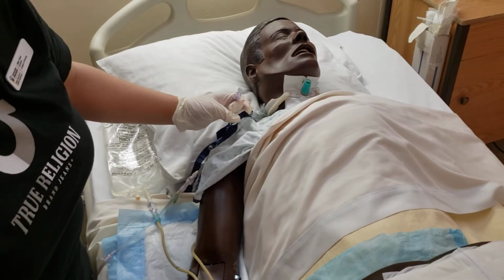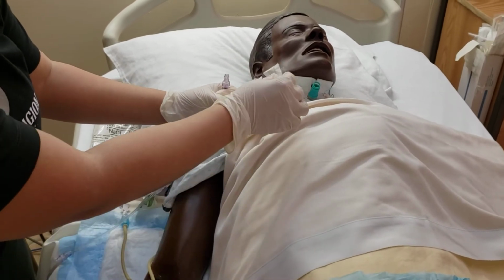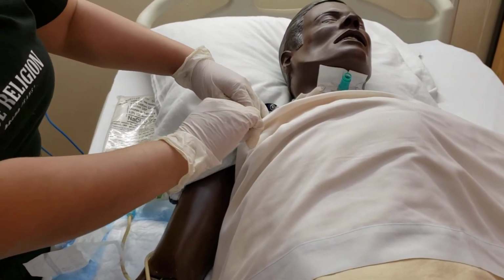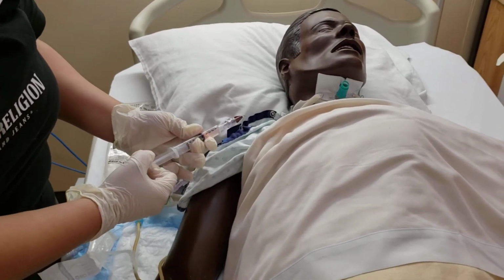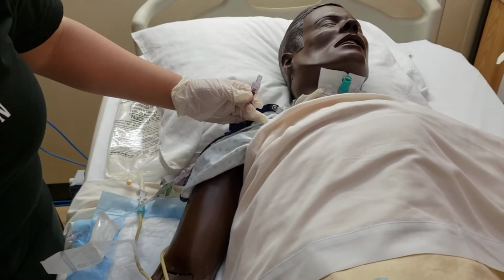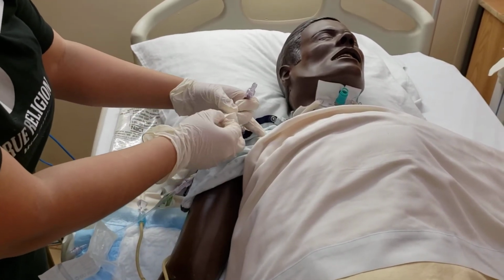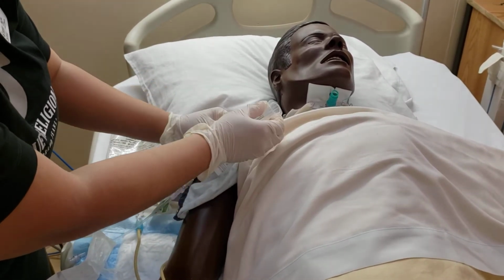And then using an empty 10 mL syringe, we are going to banana peel it. This is a sterile syringe. We will aspirate the heparin that's currently in the lock. We want to aspirate at least 6 cc's. That's a mix of heparin and our patient's blood. We will discard this later. And then we want to connect our vacutainer onto the lumen. So banana peel it and then connect those 2 together.